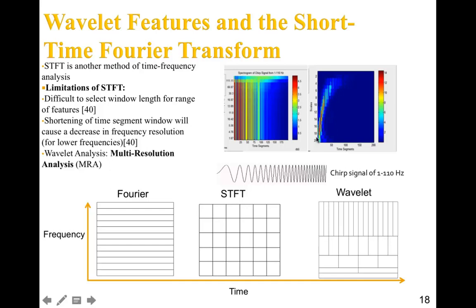On the other hand, if you use the wavelet, you can see that you get a lot of power at this lower frequency, which corresponds to higher scale early on, and then as time goes, that shifts and more of your frequency occurs at a lower scale, which corresponds to a higher frequency.